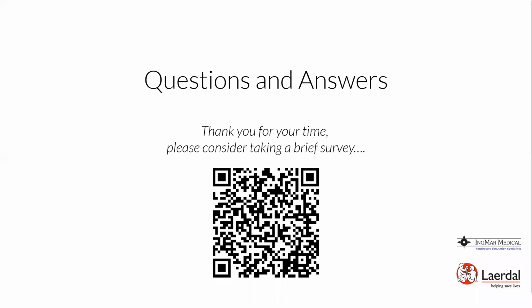The next question is, what software level or LEAP add-in should our ASL 5000 be at to optimize the use of these scenarios? LEAP version 6.3 or later is required for use with the SimMan mannequins, and LEAP version 6.7 or higher is required for use with SimBaby. And to upgrade your mannequin or your LEAP software, you can contact your Laerdal representative. We've designed these scenarios using LEAP 7, but you can, as you say, use another version, definitely.